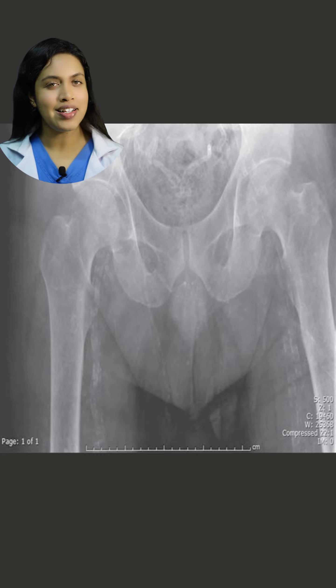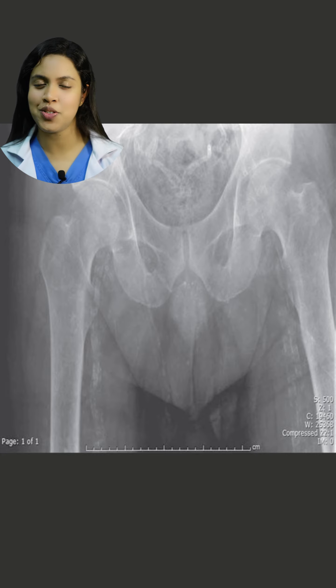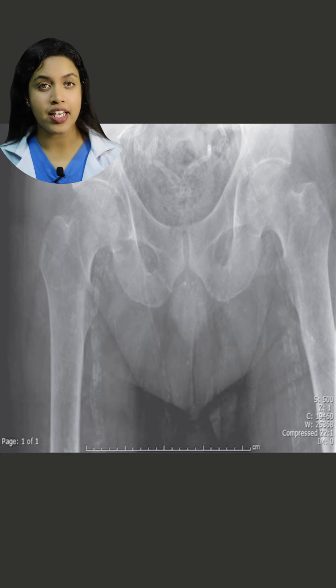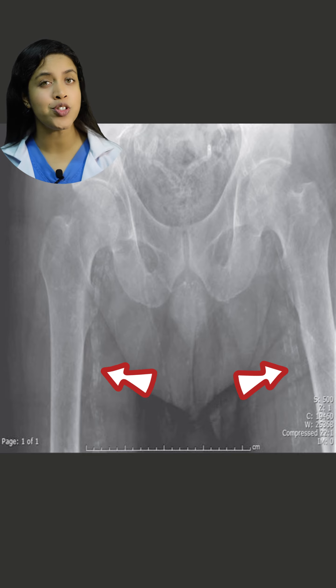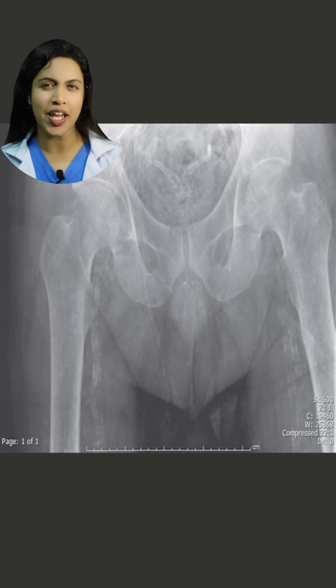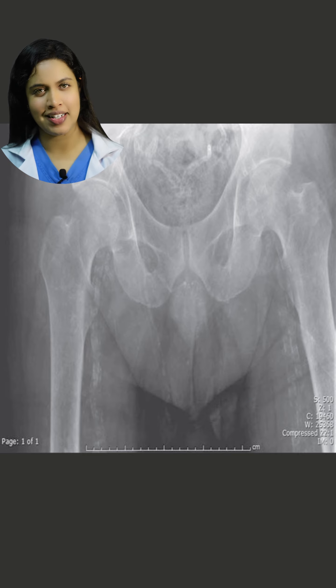Alright, let's analyze this together. The X-ray shows heavily calcified arteries and osteopenia, but no acute bone abnormalities are visible. However, given the patient's clinical presentation, further imaging is warranted.